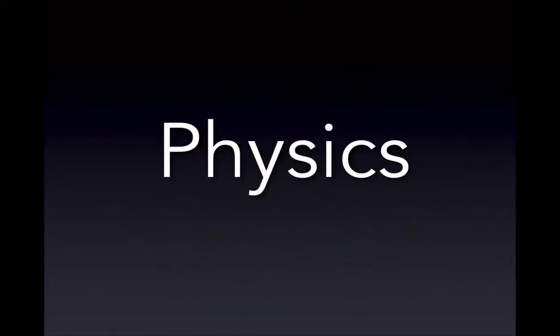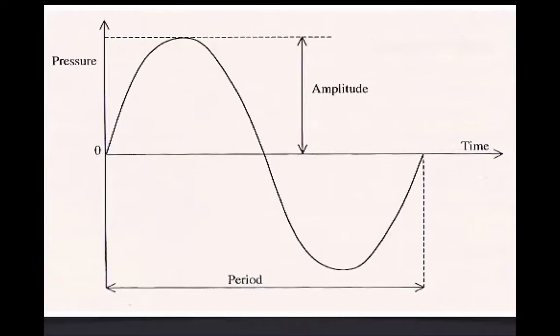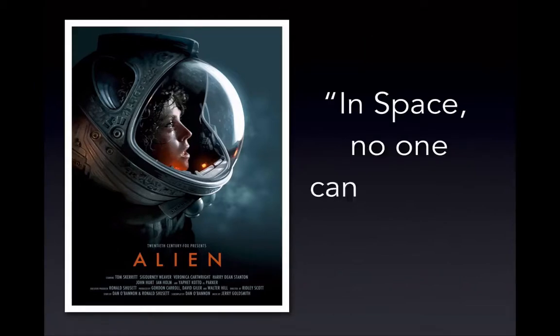So when we talk about ultrasound, we have to talk about physics, and when you hear the word physics, that's kind of what I look like when I hear the word physics. But we know briefly we have to describe that sound waves are mechanical because they carry energy, and you have what looks like a typical cycle of a wave there. We have amplitude and time, and basically for the sci-fi fans out there, and I'm a hardcore sci-fi fan, the slogan for this movie was, "In space, no one can hear you scream."